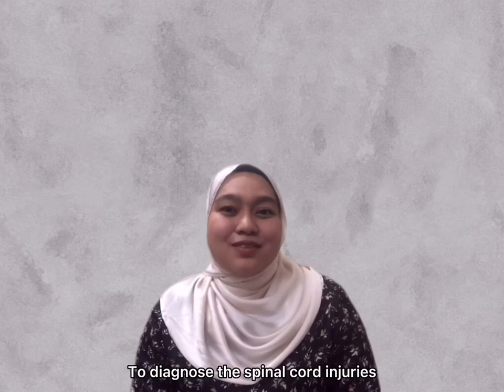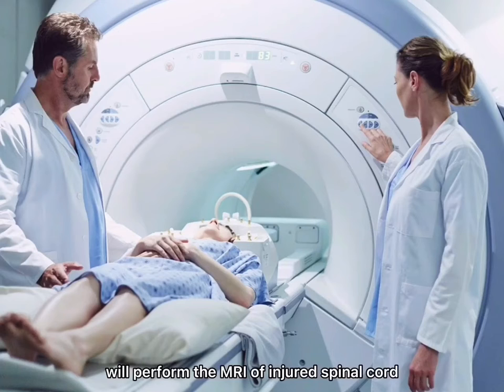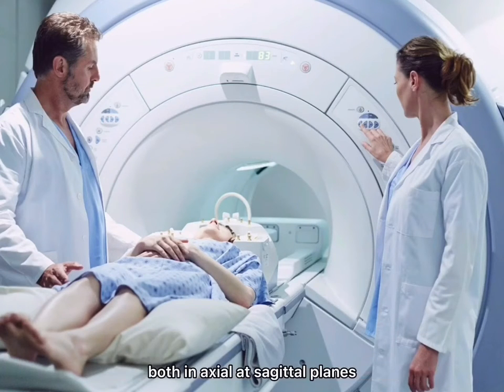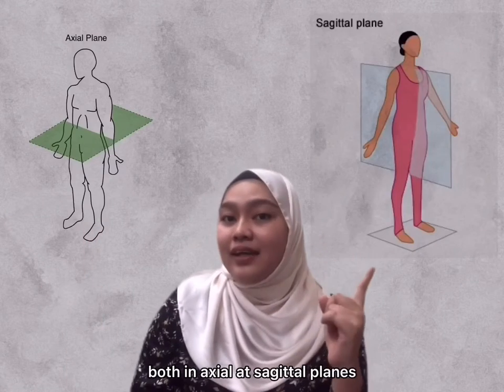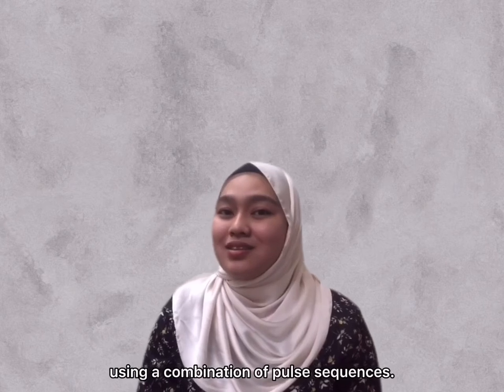To diagnose spinal cord injuries, the technologists will perform the MRI of the injured spinal cord in both axial and sagittal planes using a combination of pulse sequences.